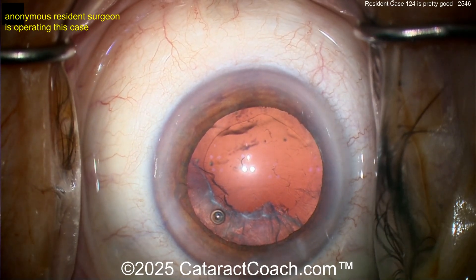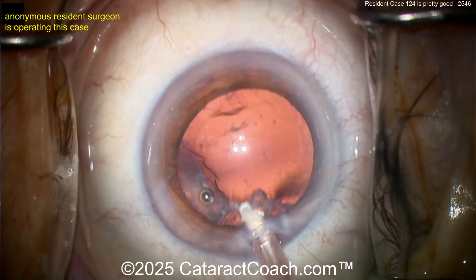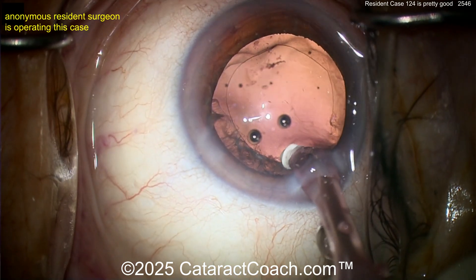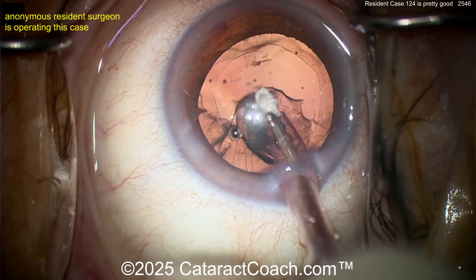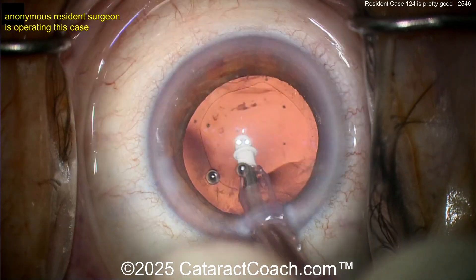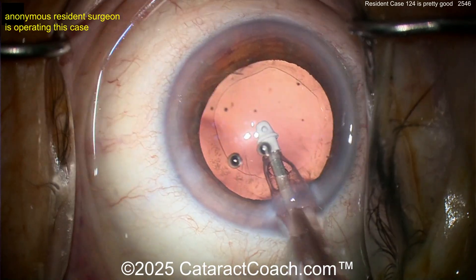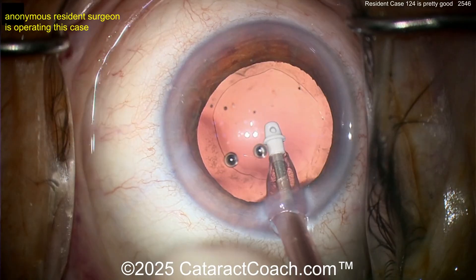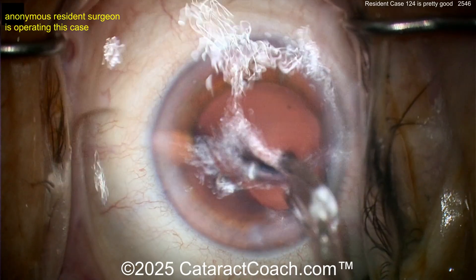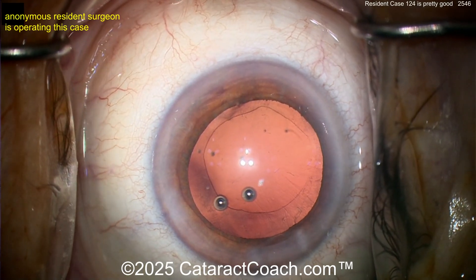Now at the end, time for cortex removal. Looks like a coaxial I/A probe — that looks great. I like how you take your time to adjust the tip. Going inside the eye, I like going in at position one and I don't like to go in dry. Aspirating out the cortex — really not a whole lot of cortex left, that looks great. This is case 124; you want to take your time and clean up the capsular bag. Early on you're more cautious going near the capsule, but as you get comfortable, you'll do more cleanup.